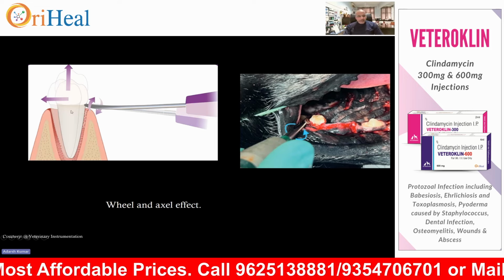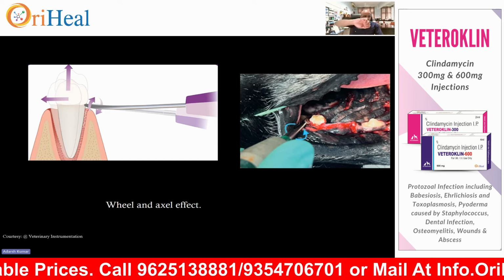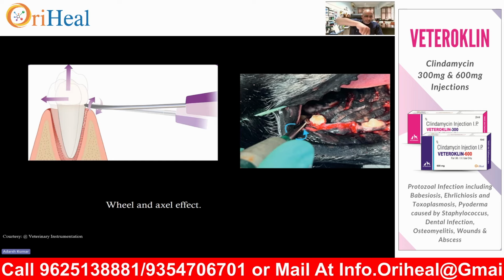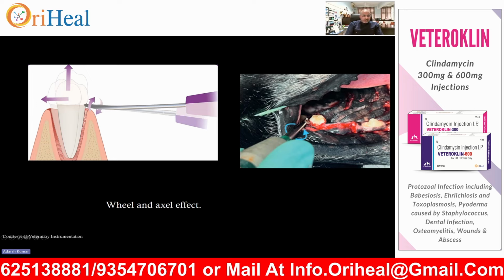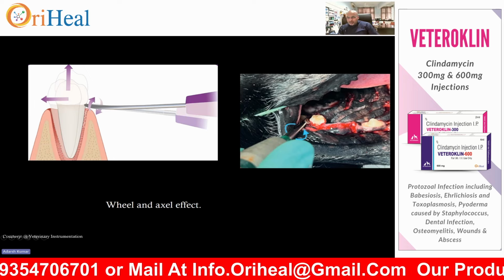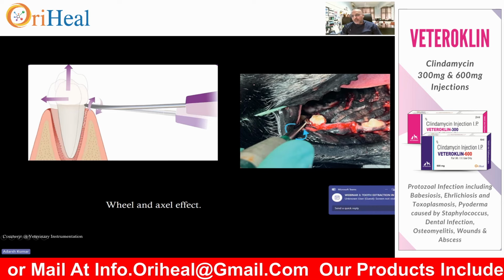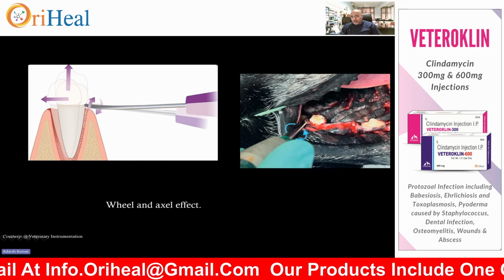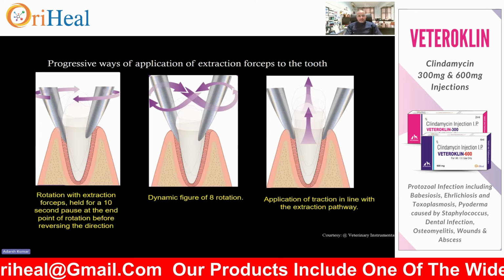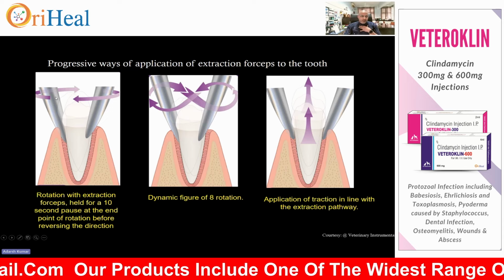Now, once the space is being created, you can rotate this elevator inside the cavity and inside the alveolar socket like a wheel and axle. Can you see the movement here? I'll show you in the pictures from where I have done, so that you loosen almost the whole of the attachments of the tooth within the alveolar socket. So once you take it out, then comes the role of the extraction forceps.